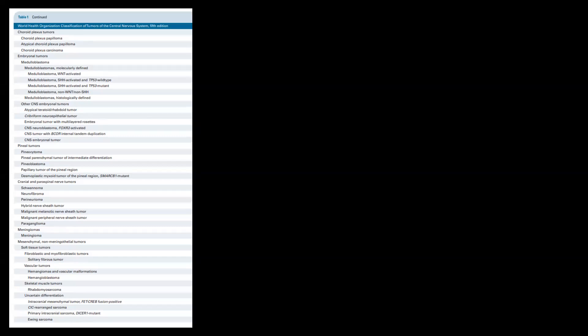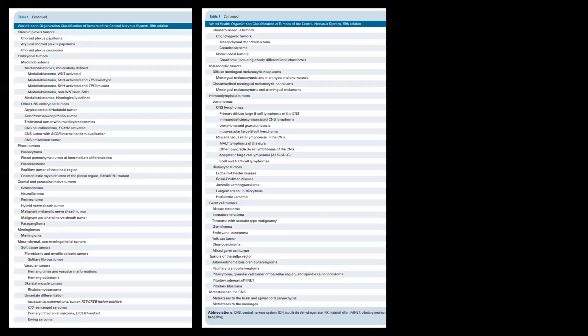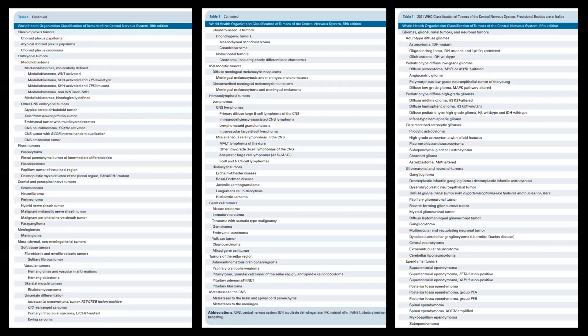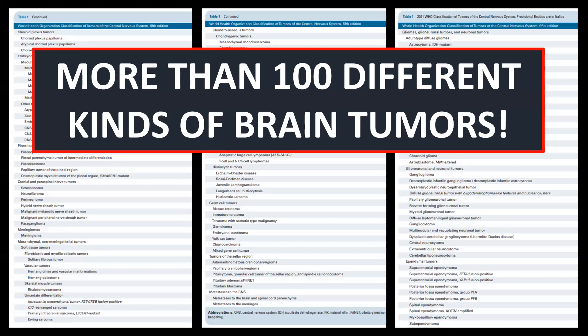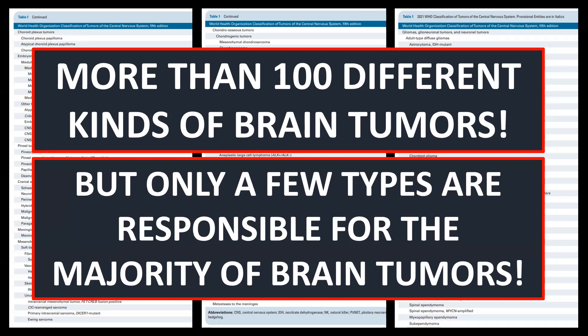Looking at primary brain tumours, there are an awful lot of them. The latest WHO 2021 classification includes over a hundred different kinds. It seems impossible to know them all, but it's not necessary, because despite this extensive list, in daily radiological practice only a small group of tumours constitutes the majority of what we encounter on scans, and many listed tumours are so rare that most radiologists will never see them.